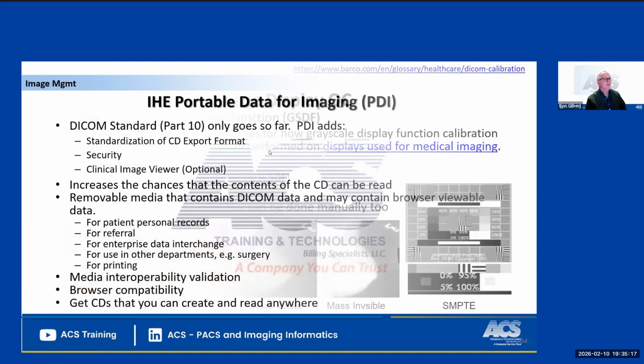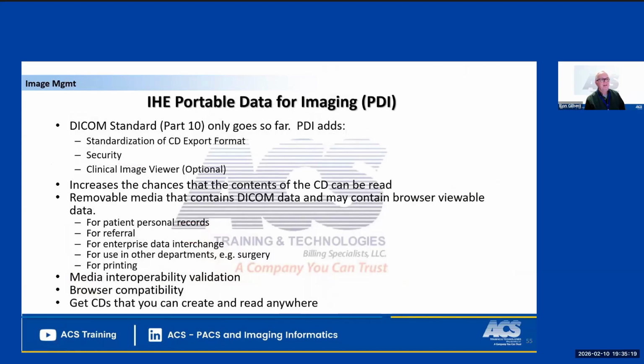And then you're going to have to learn also what some of the IHE standards are. How do the different systems talk to each other? Like, how does the PowerScribe dictation system know that there's multiple images for the doctor to read?